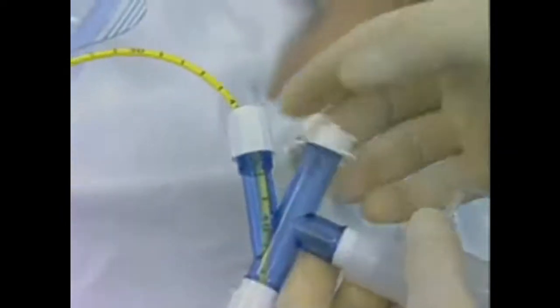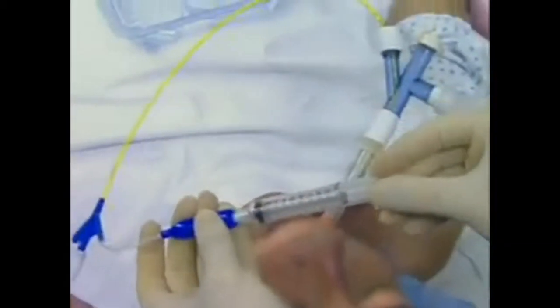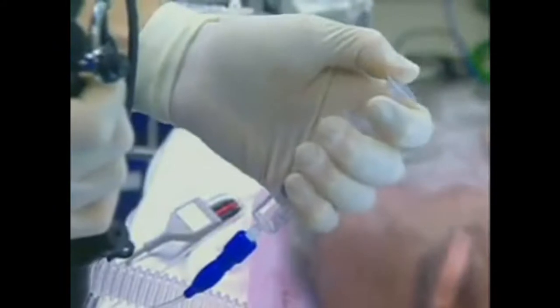The blocker port of the multi-port adapter is tightened, ensuring that there is no escape of gas and that the blocker does not move within the multi-port adapter. After assuring that the blocker is in the correct lung, the balloon is deflated and the bronchoscope port closed. The patient is positioned for their surgery, and once again the balloon is inflated to allow the surgery to proceed.